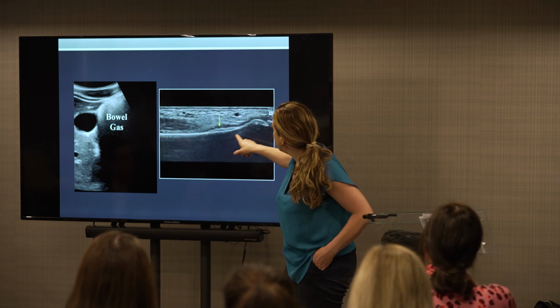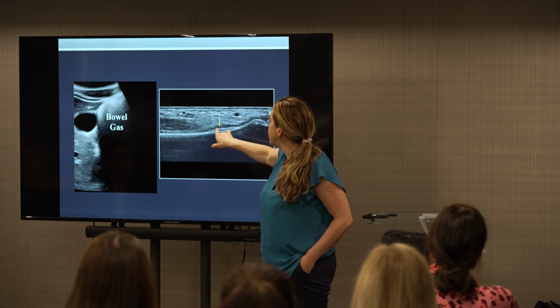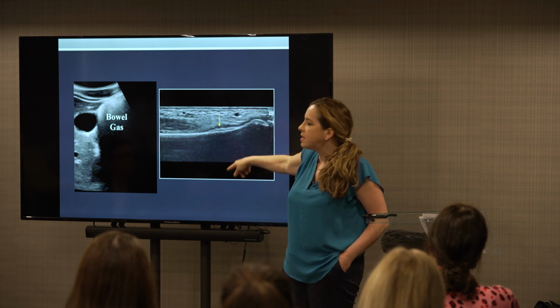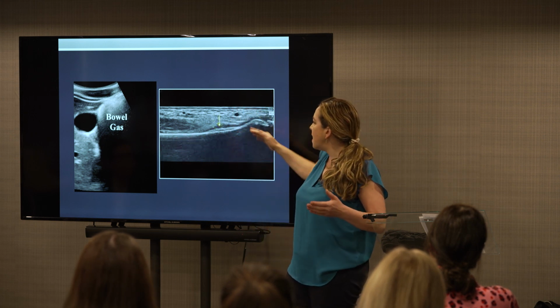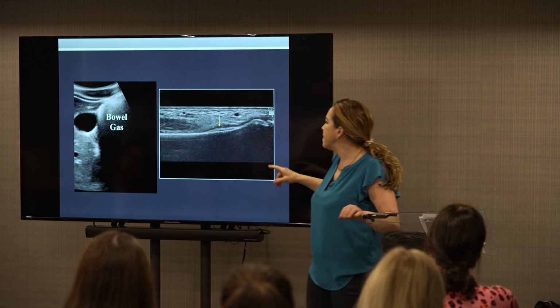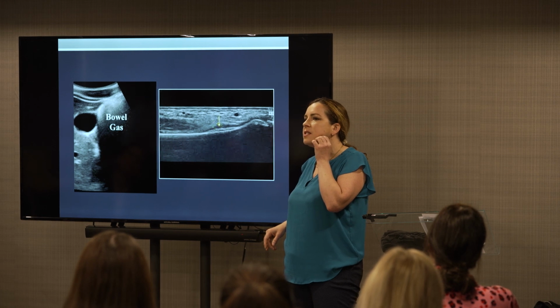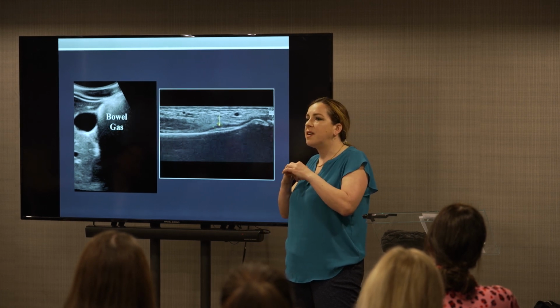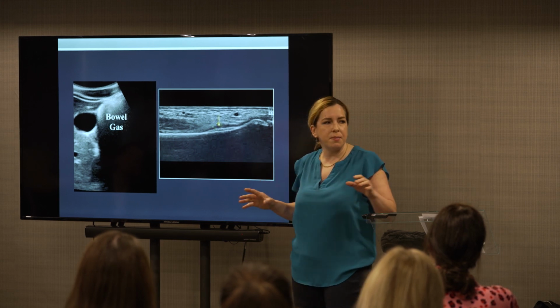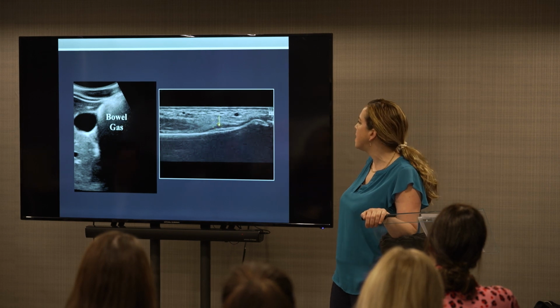This is a bone, some kind of long bone. This is a bit of periosteal reaction. So you can see that really nicely. But deep to the intact cortex of that bone, you can't see any information what's going on deep to that. You can, though, sometimes use it in the mandible to see defects, infections. You can sometimes see very fine fracture lines that you can't even see on X-ray. So it is useful in some respects for bone, but not for seeing deep to an intact cortex. Next slide.